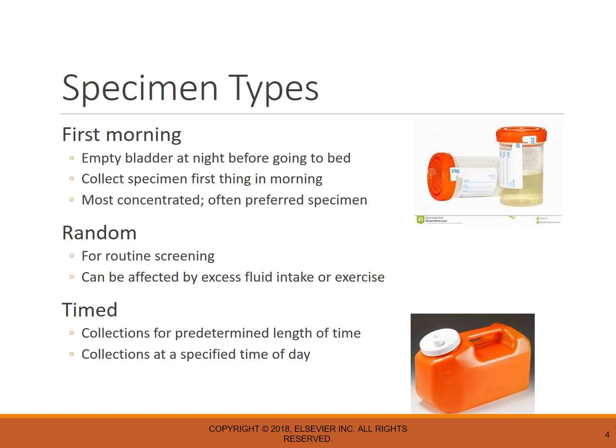quantitative urine assays often require a timed collection. Timed collections, usually either 12-hour or 24-hour, eliminate the need to determine that excretion is optimal and allow comparison for patterns from day to day.